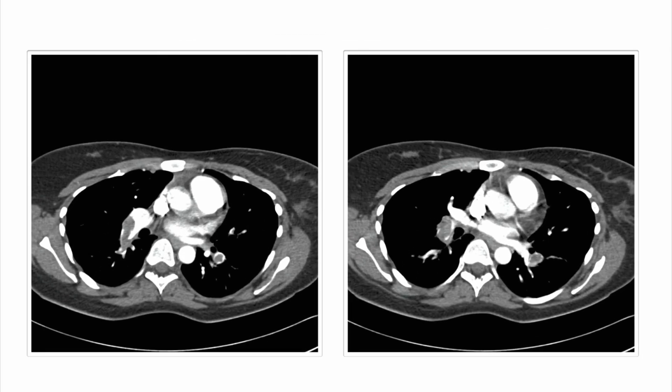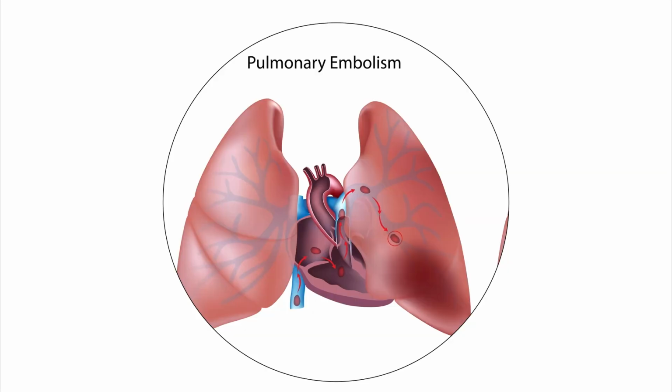And what we're afraid of is that the right ventricle fails and that the patient will get into cardiogenic shock. And the diagnosis was confirmed with CT. You can see in the two branches of the pulmonary artery, there are several thrombi. So this was a case of pulmonary embolism. And it clearly shows how echocardiography is important in assessing these patients. Now, if you have small pulmonary emboli, you will not see anything with echo. But if the patient has a massive pulmonary embolism, you will.